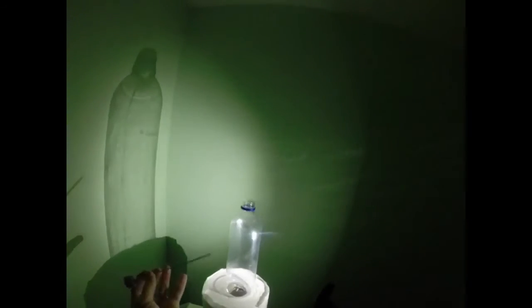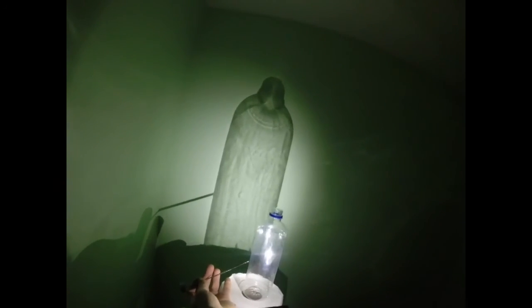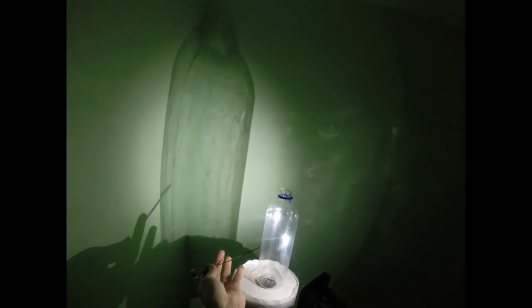With my needle approaching midline and positioning the light source straight in the lateral view, I can see the needle tip touching the midline or edge of the shadow. When I go for a contralateral oblique view, I can see my needle deep inside the shadow.